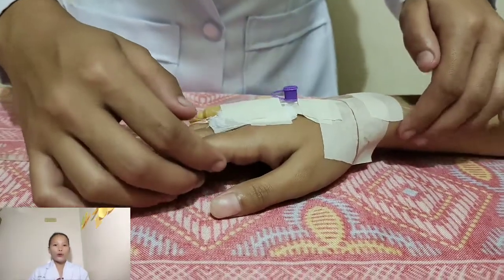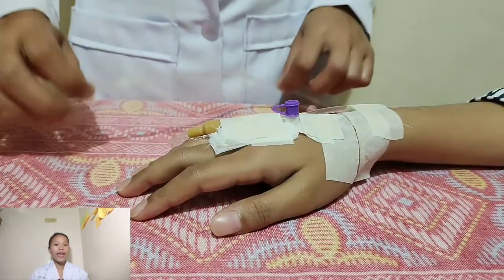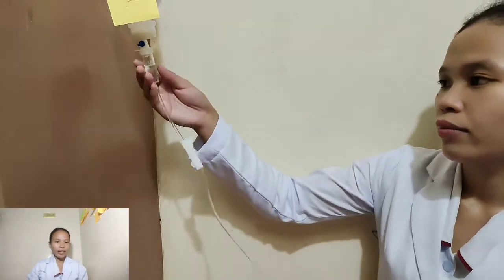Perform hand hygiene, and inspect the IV site for signs and symptoms of IV-related complications such as pain, swelling, or redness. Observation or report of any IV-related complication indicates the need to re-establish patient IV access. Observe for patency of IV tubing. The IV line must be free of kinks, knots, and clots for fluid to infuse at the proper rate.